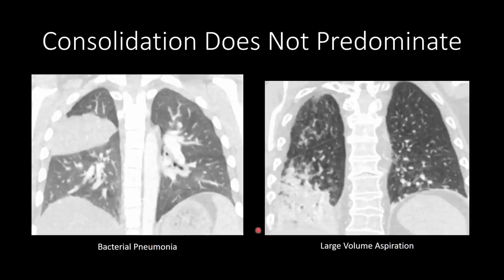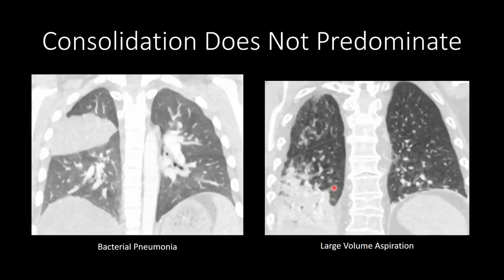In viral pneumonia or coronavirus-associated pneumonia, consolidation does not predominate. Here is a case of classic bacterial pneumonia in a segmental distribution — almost a lobar distribution — with consolidation being the predominant finding. We also have a case of a patient with dysphagia who presented after large volume aspiration in respiratory distress, where consolidation is the predominant pattern, which is not the pattern of organizing pneumonia.